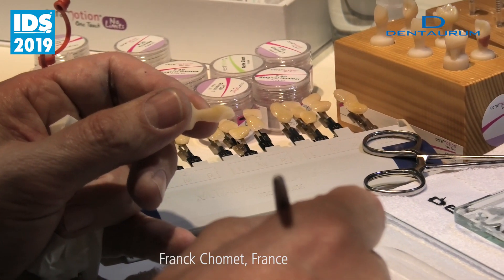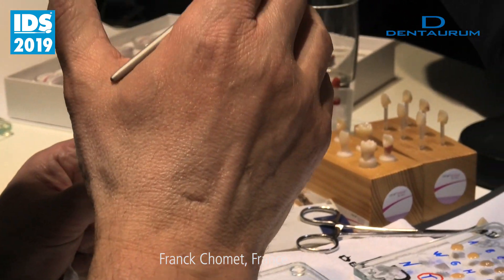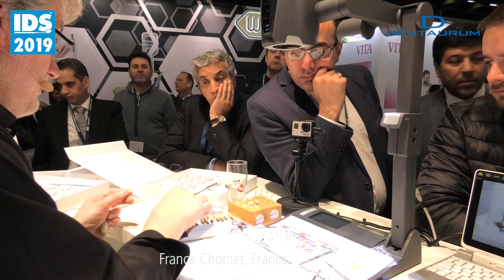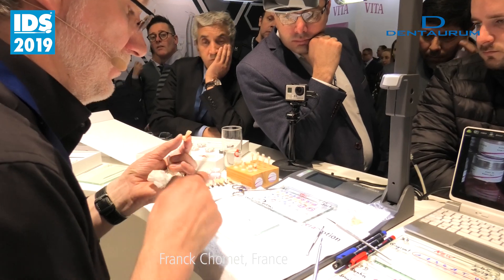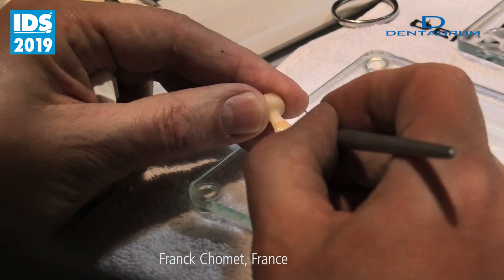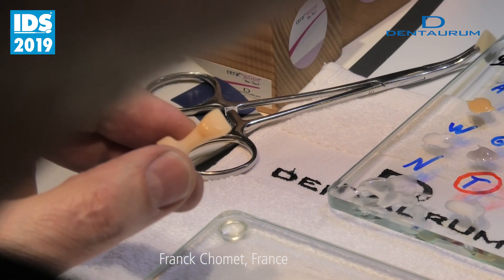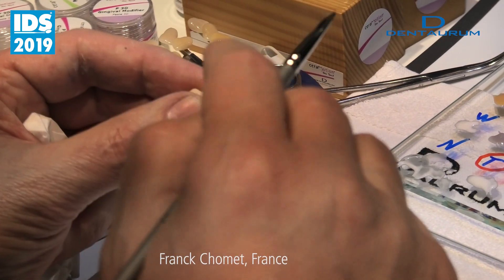Glaze — for example, if I put this one with a bit of this one, I'm going to create my glaze — I will say yellowish, etc. Of course, you can also use directly on the crown. For example, if I want to put some color, I can start to put some color at the cervical area. One thing is very important: what you see, what you get. That's a bit different, because you see on the crown what you are doing. When you do with powders, you have to bake before you know the result.